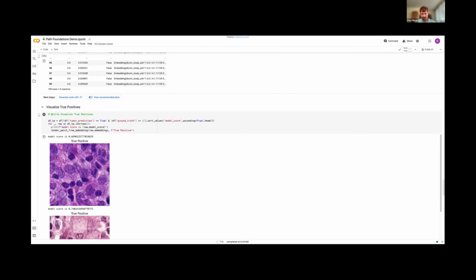In our other work, we have a number of foundation models. People have tested them on things and said, well, we didn't actually train it to do that, and found it performs really well. An example of that is our chest X-ray foundation model, which is similar to this. This is on adult chest X-rays, and we had a collaborator work on abdominal neonatal X-rays, and had really good performance out of that. So even though it wasn't something we'd necessarily expected to work on, it did quite a good job. So if you're interested and you have the patches available, you can throw them in the model, and it's not very hard to see if it actually learns something from that.